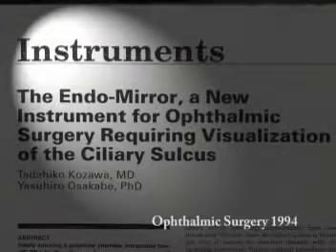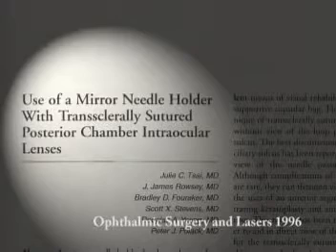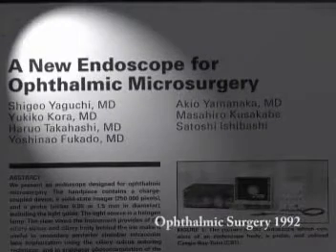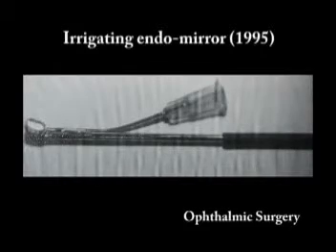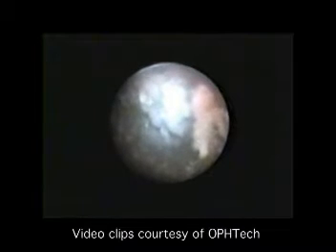Several mirrors and an intraocular endoscope have been developed to view this hidden zone. Unfortunately, however, with the exception of the endoscope, these instruments are not commercially available. The endoscope, however, is expensive, complicated to use, and time-consuming. What else can be done to observe the area behind the iris?